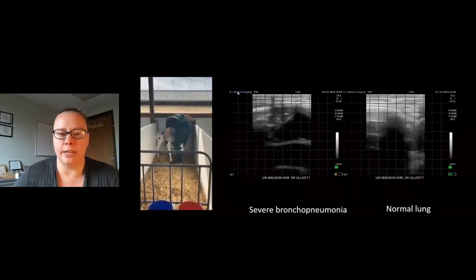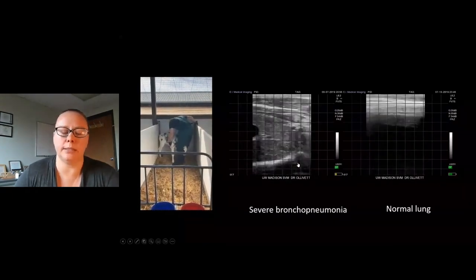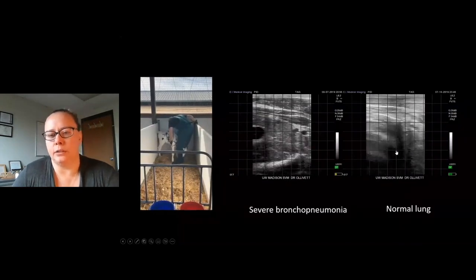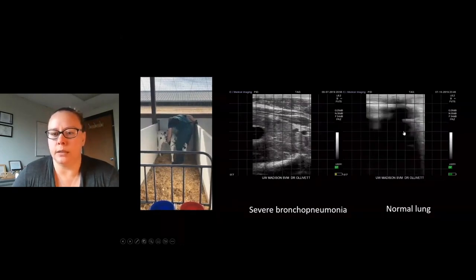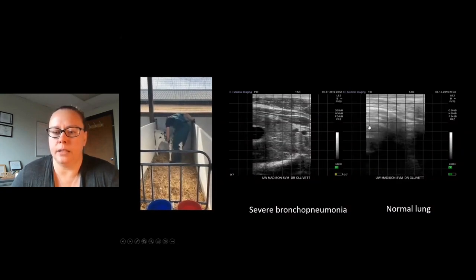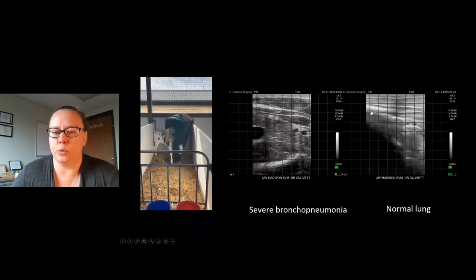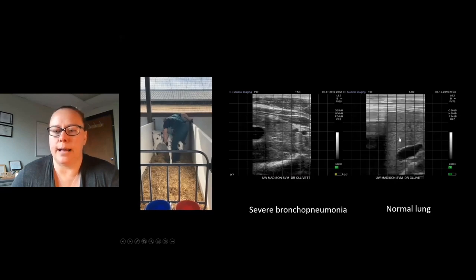And what we can see are the images shown here to the right. I'm going to pause this one on the right. And actually, I'll go back here, so that if we look at the loop on the right, that's the normal lung. And I'm showing you this is one lung lobe. Here's a second lung lobe. The same. Third lung lobe, fourth lung lobe, fifth lung lobe, back to the front. This is the whole scan, what you've just watched. It takes about 15 seconds to do a scan from the front to the back of the calf.